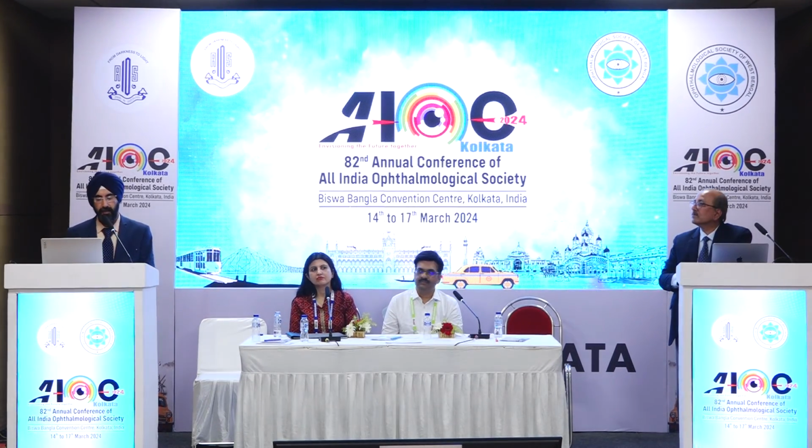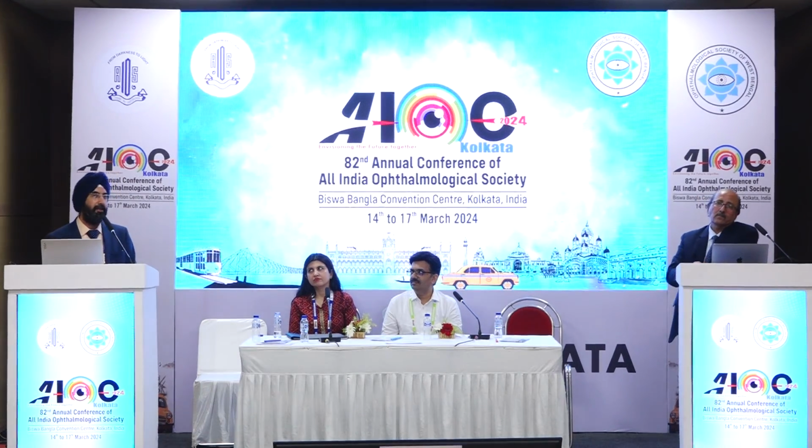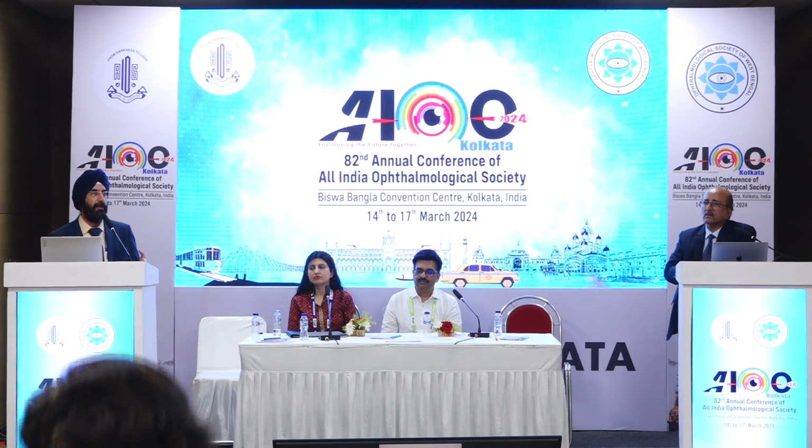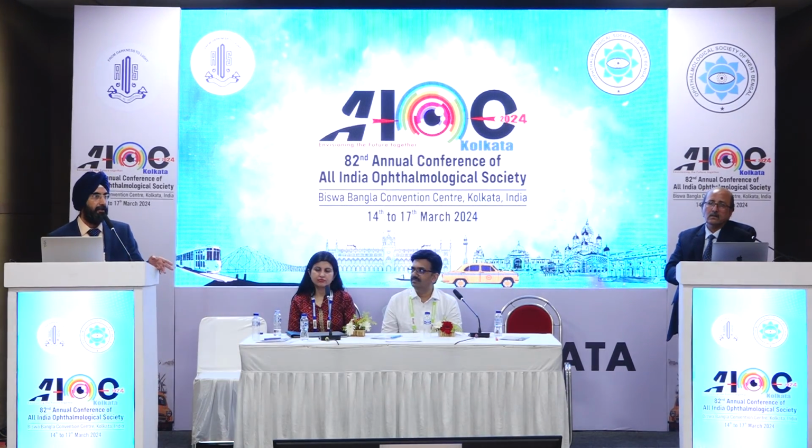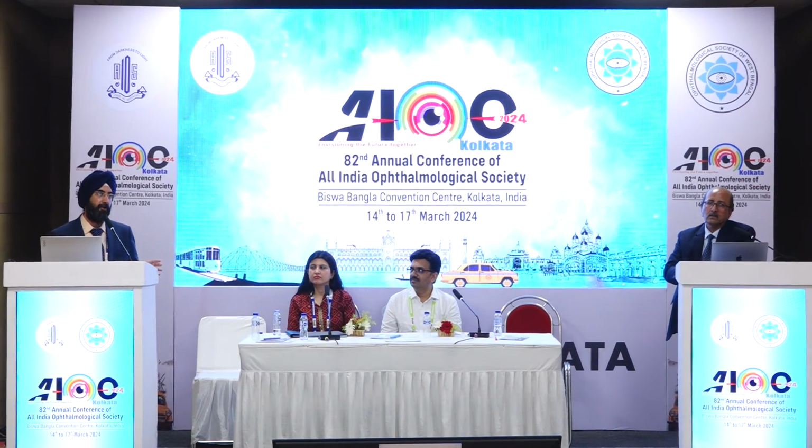Up till about 6 years is what's described in the literature as well. After 6 to 8 years, if the child is cooperative for a YAG or something, probably yes, you could avoid it. But again, try to do just a posterior capsulotomy, not an anterior vitrectomy. Up till 6, you have to do an anterior vitrectomy. But after 6 years, just do a posterior capsulotomy. And after 8 years, depending upon how cooperative the child is, or if the patient has uveitis or something, then yes, you do all those things. But otherwise, you can leave it.